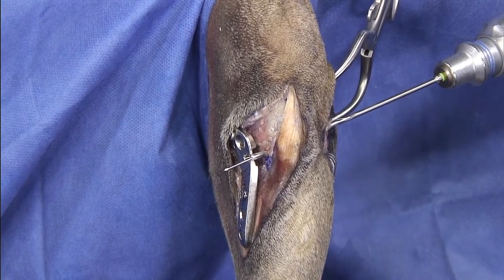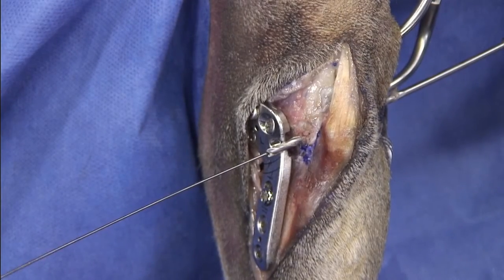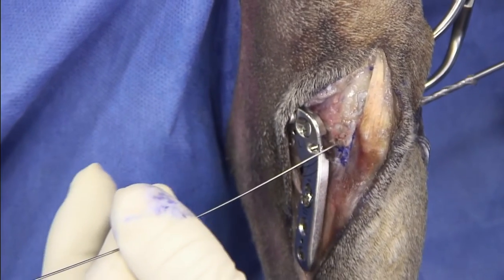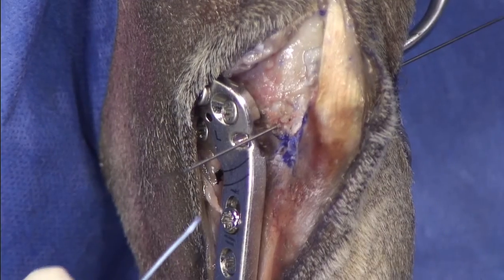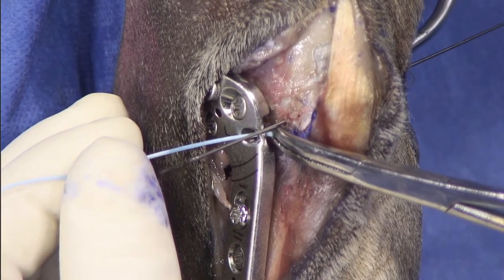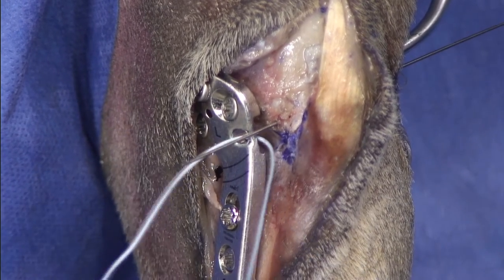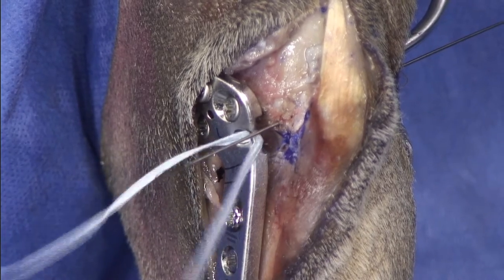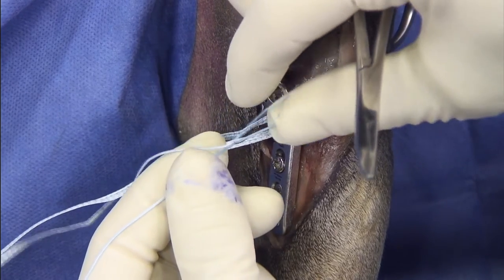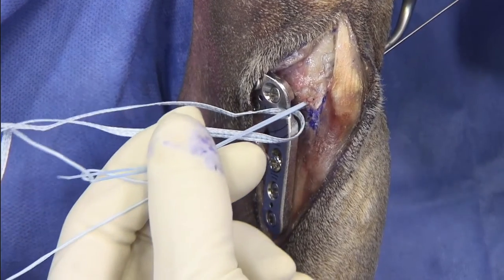At this point I like to leave the drill bit in and remove the K-wire, then insert the nitinol needle — pushing the nitinol needle in at the same time I'm removing the drill bit. With the nitinol needle in place, I'm passing the fiber tape into the suture hole, grabbing the fiber tape with the mosquito, and pulling it all the way through. I then take the two ends and pass them into the loop of the nitinol needle, and pull the fiber tape through.